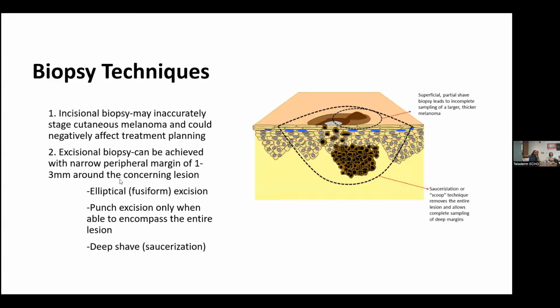It's easier and quicker. If you look at the picture, if you do just a superficial shave, you would miss the depth. So you would always want to go under the lesion. You do a deep shave, and that way you can remove the lesion and find out the depth of the tumor. So in our patient case, we did a deep shave biopsy.